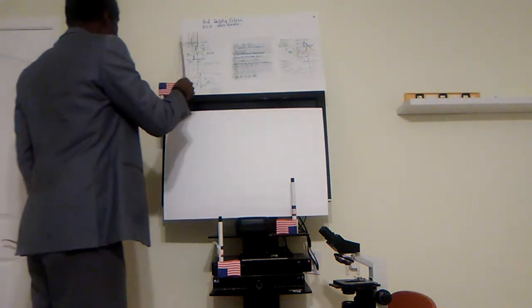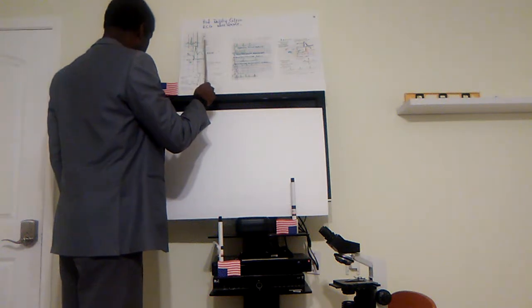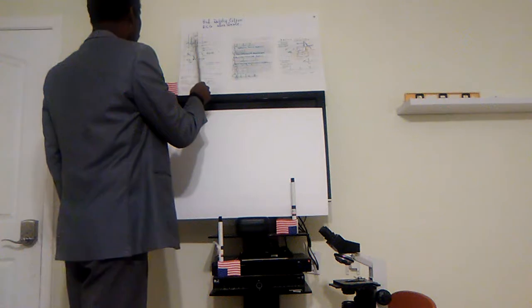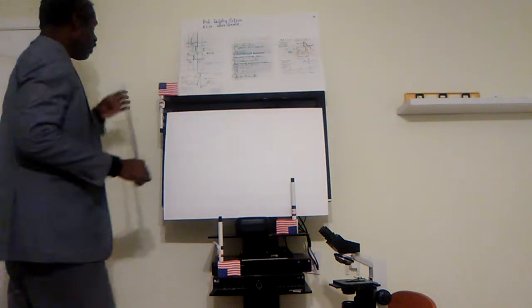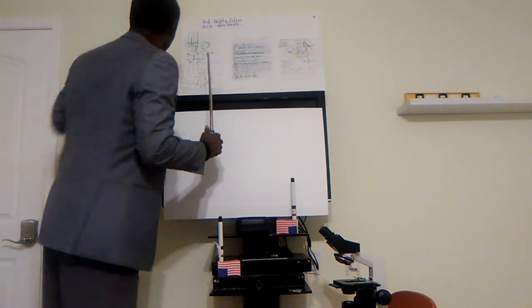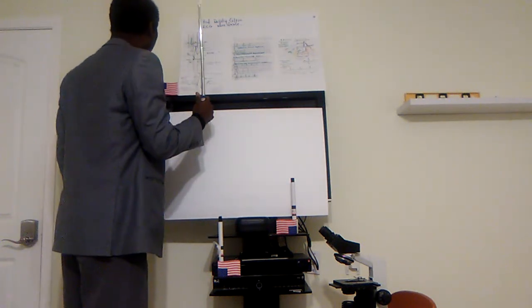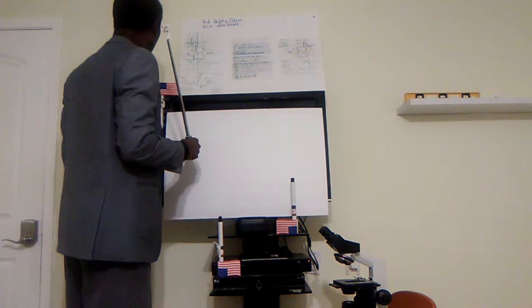At the top here, you can see that we have generated a normal ECG, and it's on the ECG paper. This is a representation of normal ECG paper magnified to a certain scale, because the small square is supposed to be 1 millimeter, and one large square is supposed to be 5 millimeters.